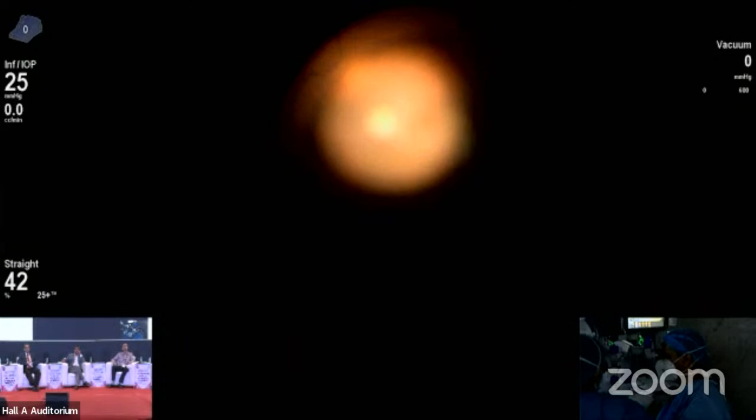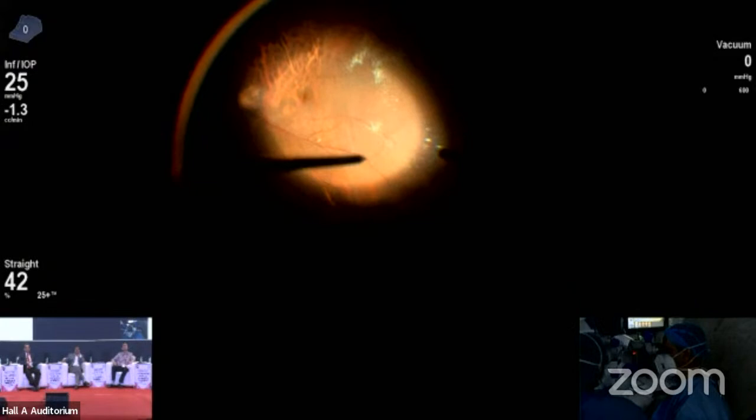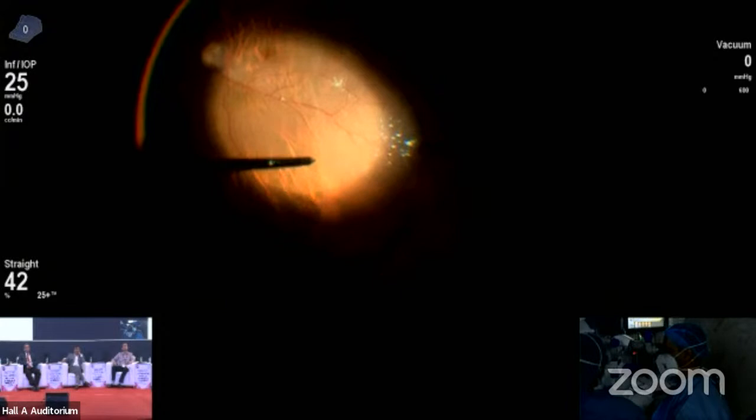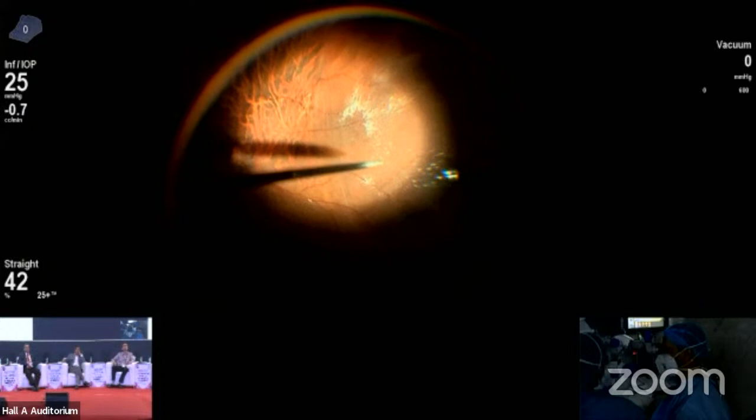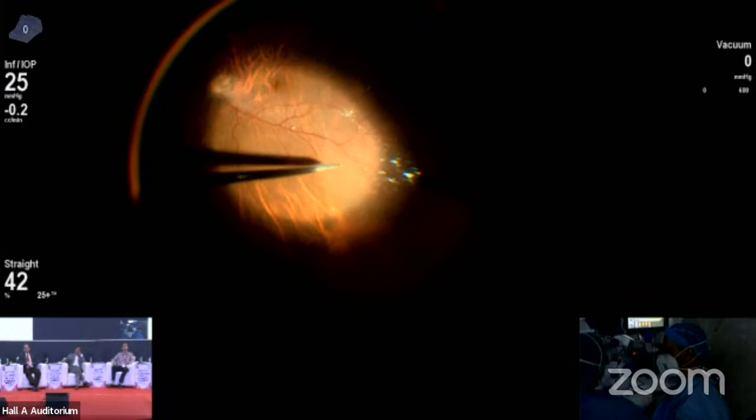So now if you notice, most of this RD is temporal, and choosing the site of retinotomy may be a little tricky, because normally we would make it on the supranasal side. And this is the maximum height of fluid, but then again, it will be too close to the macula on the temporal side. So I would make it probably somewhere over here, outside the arcade, away from the macula.